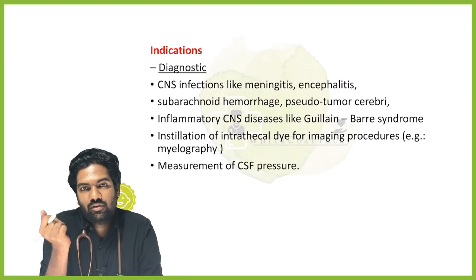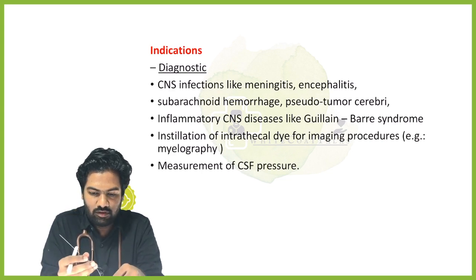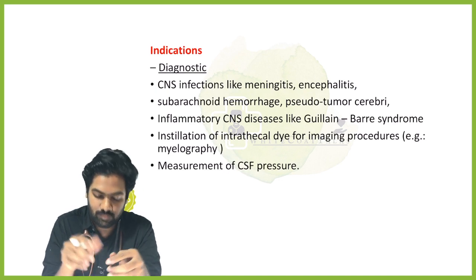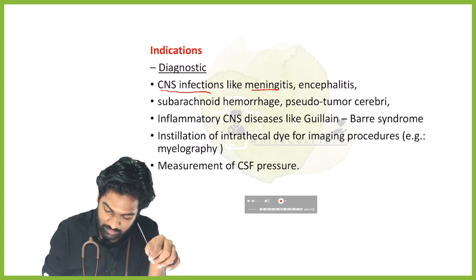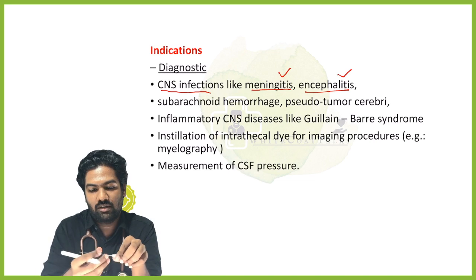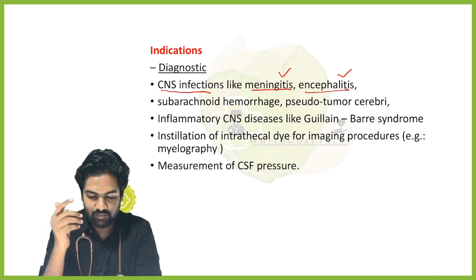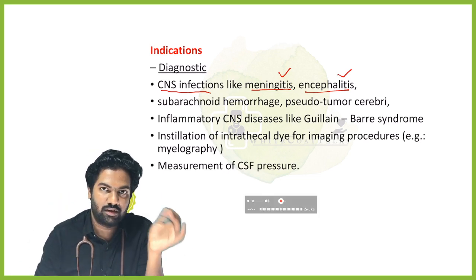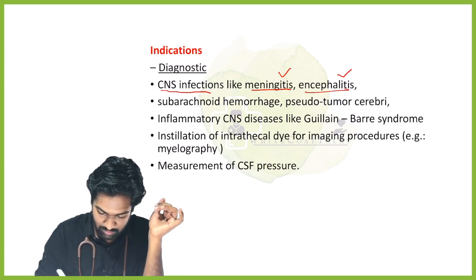Now, why do we want to use this? We use this spinal needle to do something called a lumbar puncture. Whenever we suspect CNS infection, like meningitis or encephalitis, this is the time we want to do a diagnostic lumbar puncture, and by that we can get to know whether it has occurred because of bacteria or virus, or because of something else. That is the reason why we do this LP.